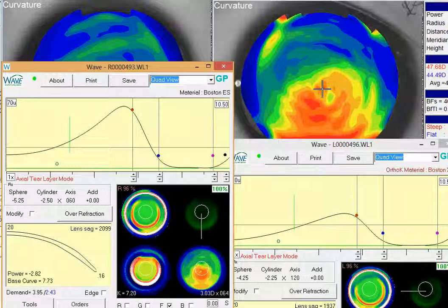However, where you're probably running into a little difficulty is you've got a pretty small landing zone here relative to the entire lens fit, and so you're probably putting a lot of extra demand in this area of the cornea, this outer area to maintain comfort. If you're losing comfort later in the day, you're probably running into some tear exchange issues from this landing zone, maybe being a little on the snug side.